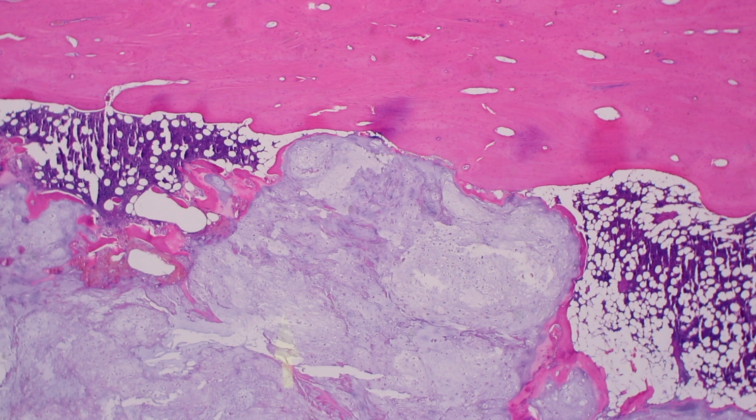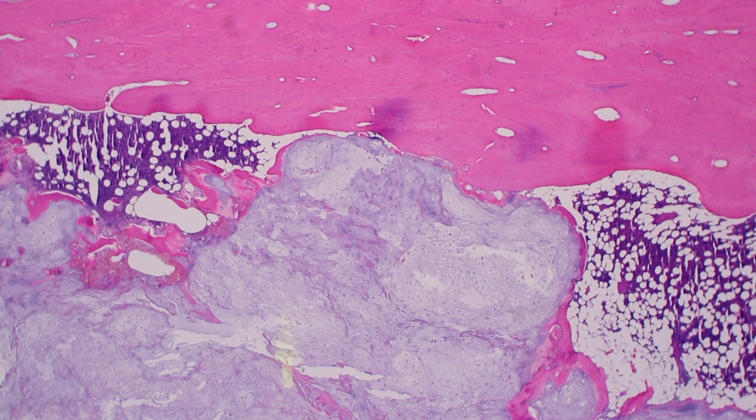Are the nodules of cartilage well circumscribed, or are they growing with an infiltrative pattern? An infiltrative pattern is characterized by the tumor replacing the marrow space and completely surrounding preserved pre-existing bony trabeculae.